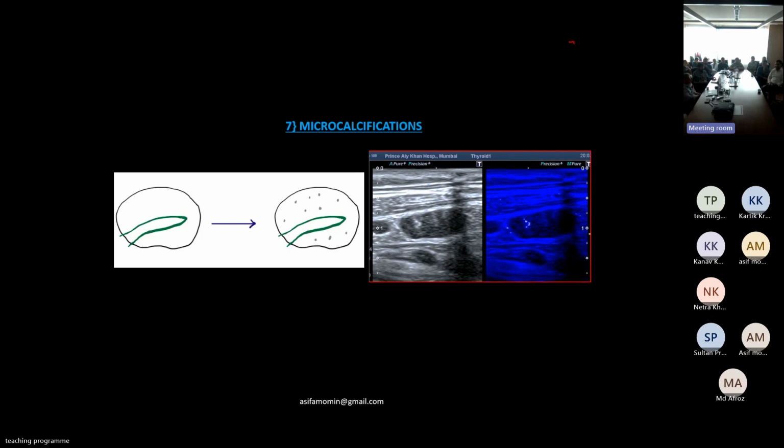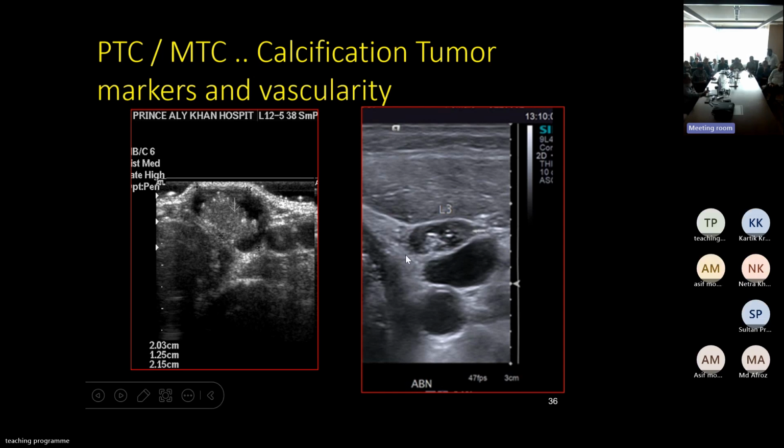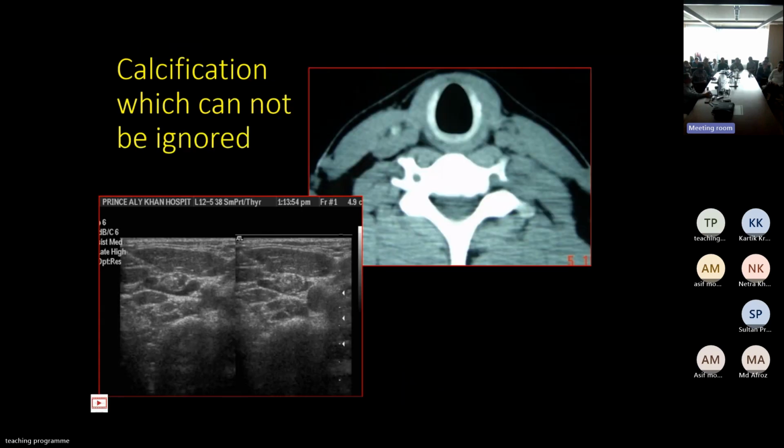So I think the next point is microcalcification, which is very important for detecting differentiated thyroid carcinomas like papillary cancers, where we tend to see psammoma, punctate, and papillary. All these three P's go together, and that is how it shines, like calcific foci, like microcalcification in breast cancer. So these are some of the varieties where we see those punctate calcifications, and we say that this node, even though it looks small, looks oval, has a hilum, but still those calcific foci will make you aware that this is an abnormal node. In fact, it can be the only clue on CT scan that only calcium is seen.